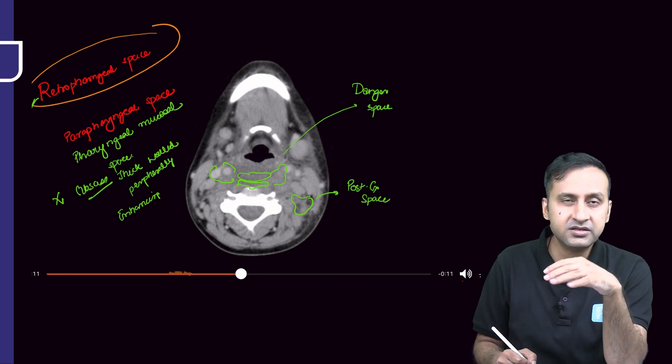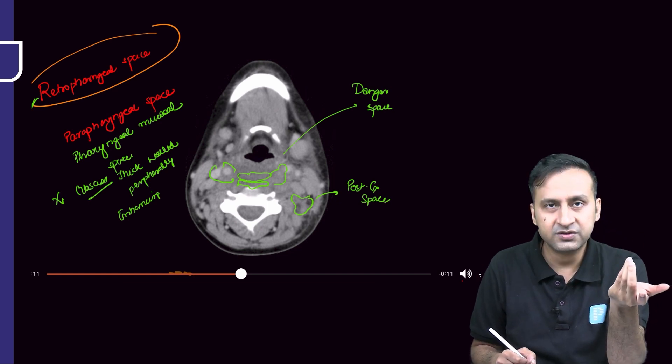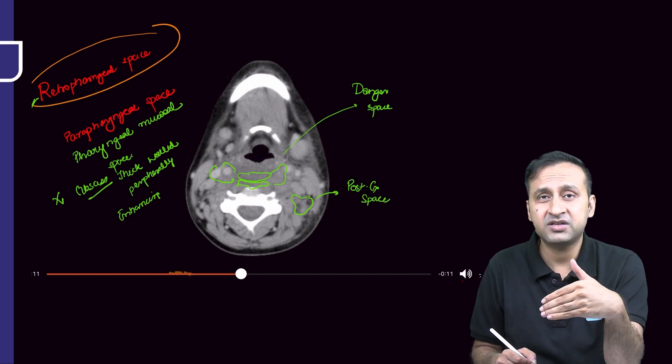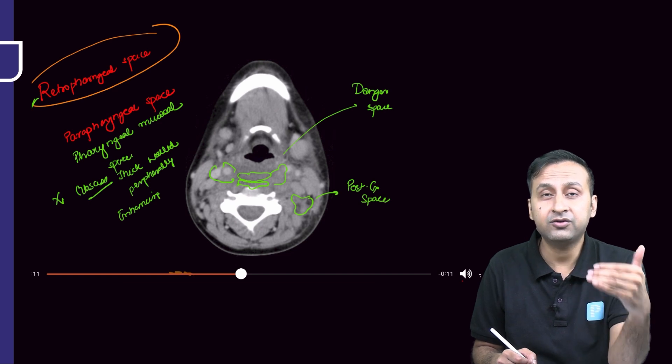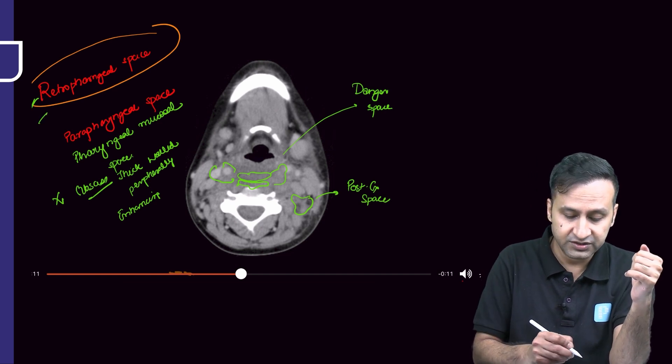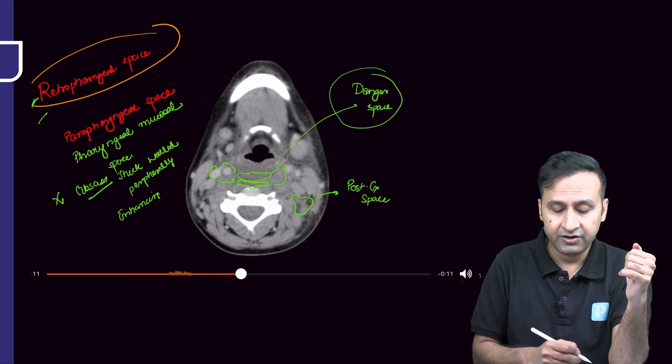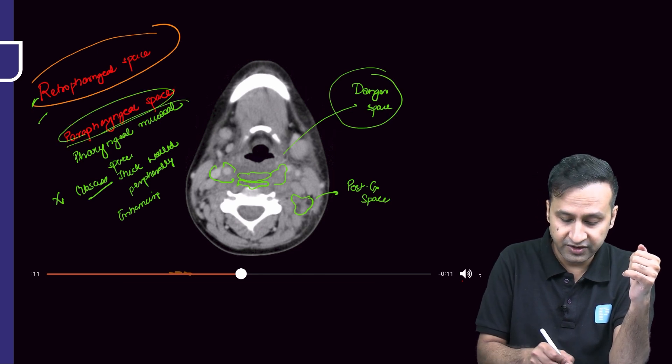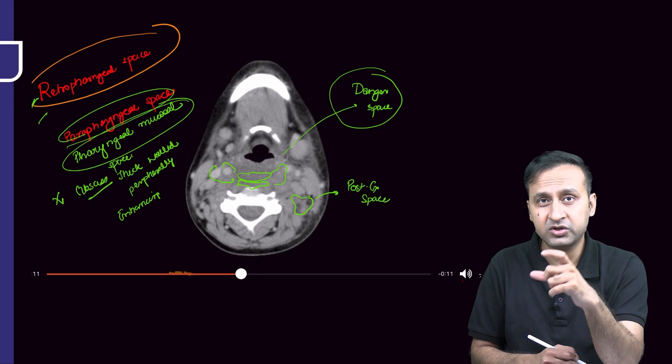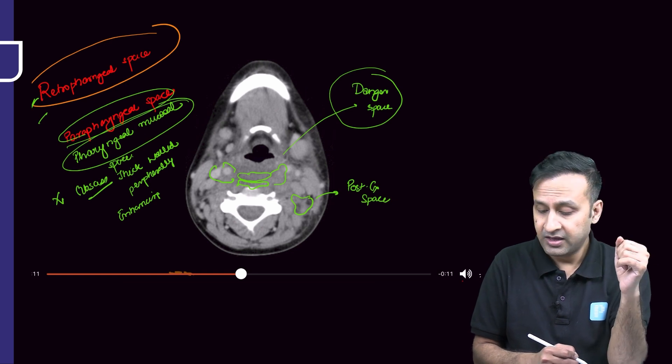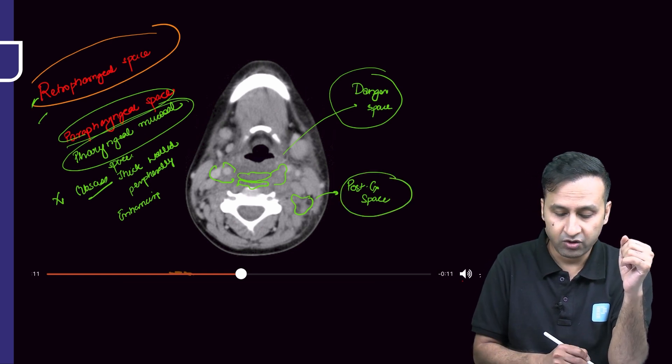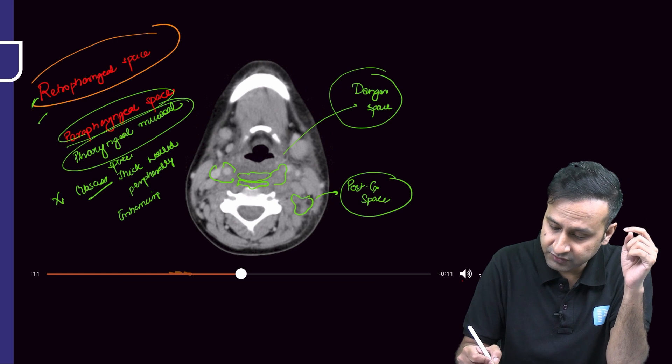This is one of those cases in which almost all the neck spaces have been involved, and those neck spaces have been involved which are very critical for life. We have posterior neck spaces like retropharyngeal space, danger space involvement, parapharyngeal space, pharyngeal mucosal space involvement along with possible involvement of the tonsillar region. We have posterior cervical space involvement and a very important thing: we have carotid space involvement.